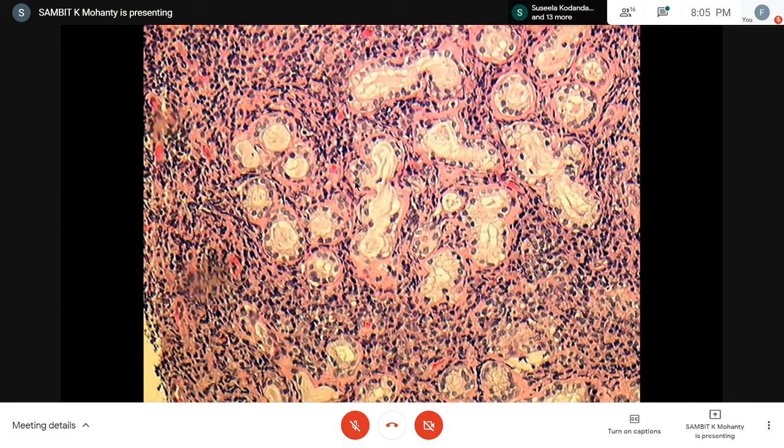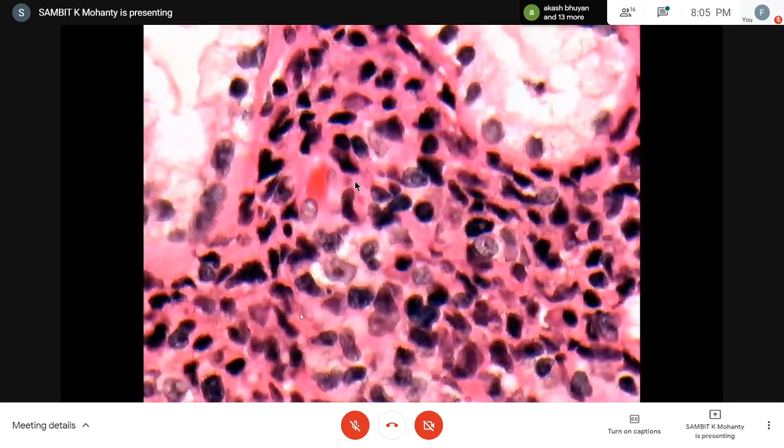They have a size of about 1.5 times that of a small mature lymphocyte. Nucleolus is not readily visible. Nuclear membrane is sort of irregular, and they're hyperchromatic. And some cells, focally, are cells with vesicular nucleus, prominent nucleoli, and look at the nuclear envelope irregularities here.